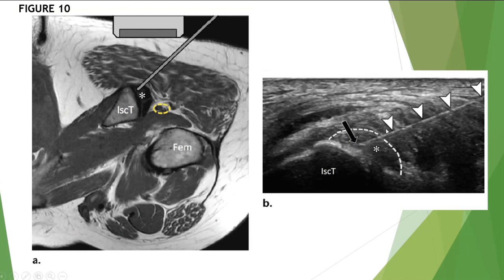We see the tip marked by the arrow itself, and the landmark of the ischial tuberosity that serves as an osseous backstop. So we reach that, and we know that that's up until where we can reach.